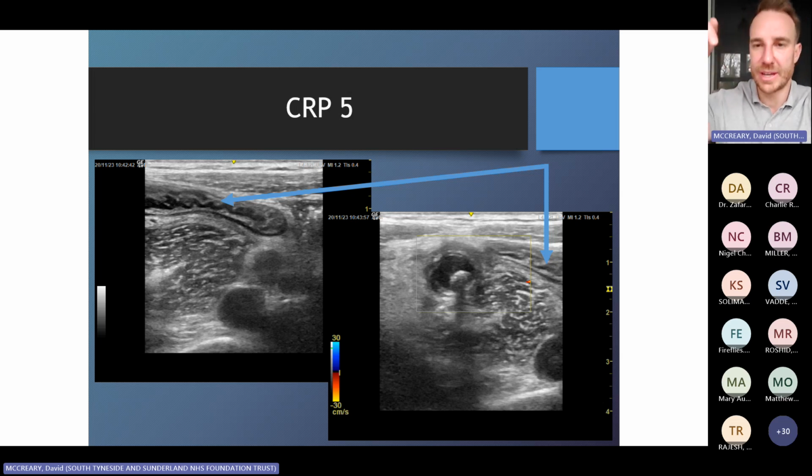Just because you don't normally get these finger-like projections of the mucosa, you just get a very straight line, like a tube, and you just get the same in transverse section. So it's just a little bit of a pitfall to be aware of, all right? But you will crack it once you do enough of these.